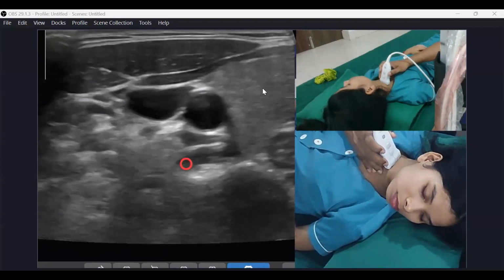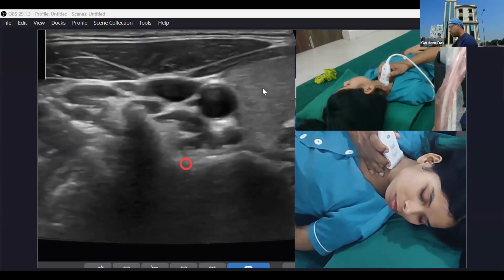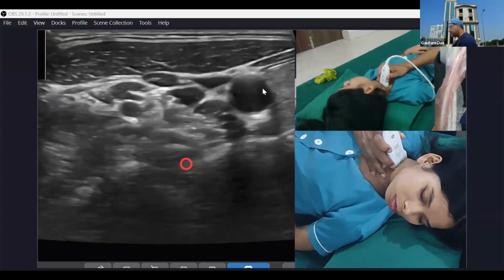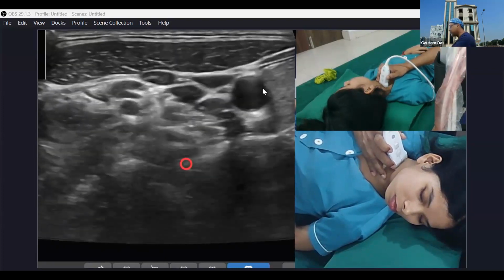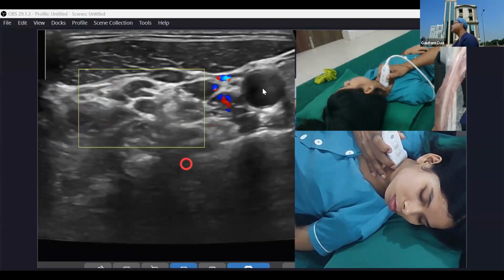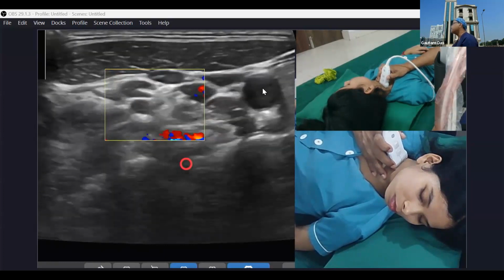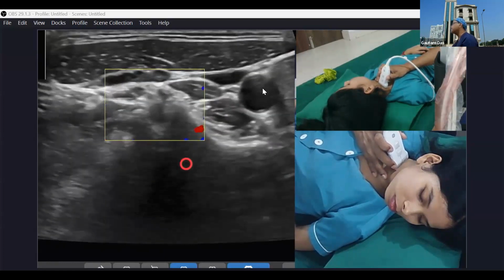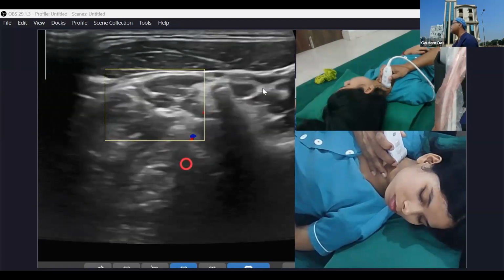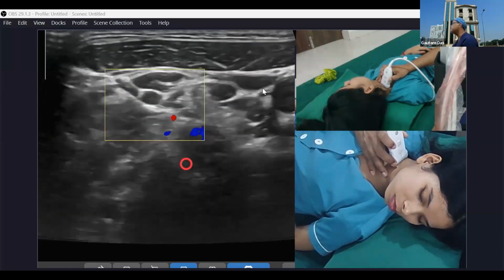Yes, sir. So now another thing you have to understand. I'm just giving some color there. Color sometimes is not accepted, but still. The nerve root normally accompanies some blood vessels. So if you are going to inject the nerve root, be aware of the blood vessels there. This is the nerve root. I'm putting it in the box and searching for the blood vessels. The black things are basically blood vessels.